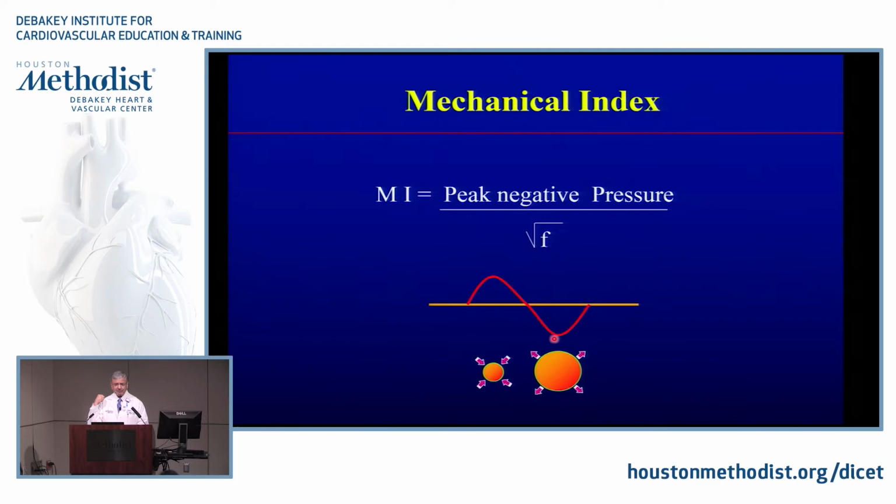You're hoping to reflect some of that to come back, and distance is all time related. That's how I know what distance is, because I know what time it took. So this packet of ultrasound that you see has a positive pressure and a negative pressure. In this tiny microbubble, positive pressure will compress it, and the negative pressure will expand it.